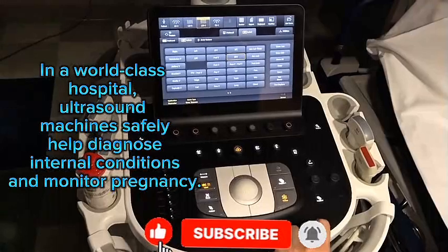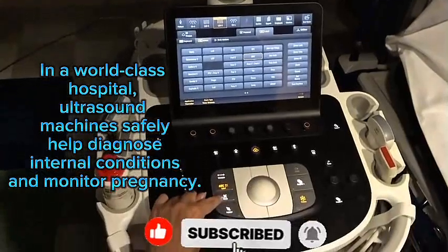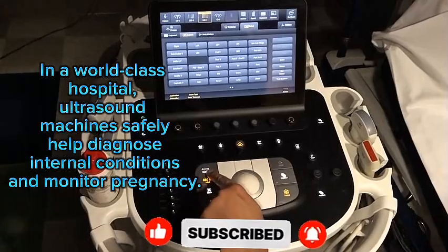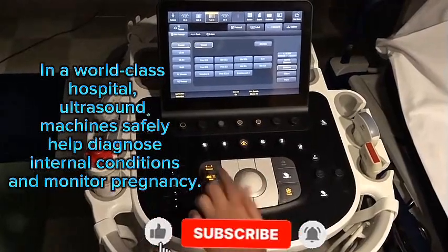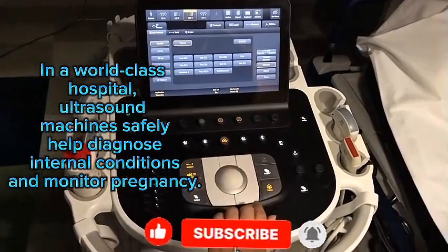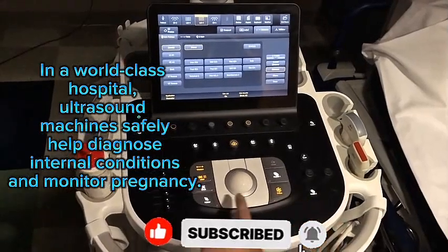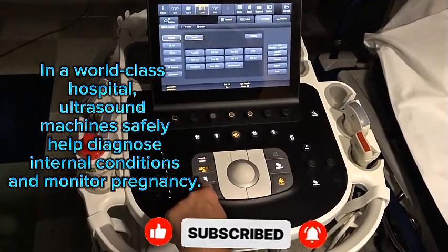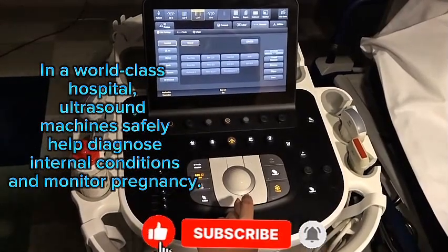So if you freeze your image and you decide that you don't want any of this annotation on here, you can simply hit this erase option. That will erase the annotation. If you want to measure something, this measurement button here will give you calipers to measure. You can select it again, move that around, and you can image store to acquire that documentation, or again, you can use the erase option to erase all of your measurements. First push erases the last, and then the next erase erases the first one.